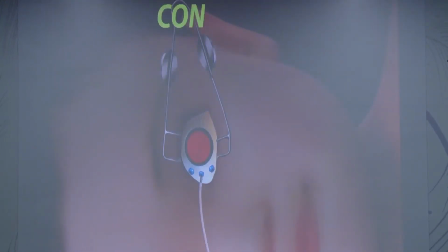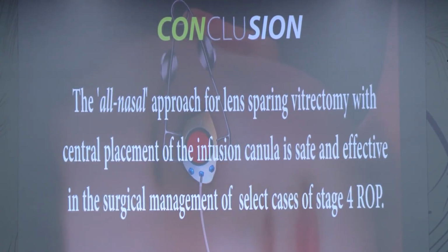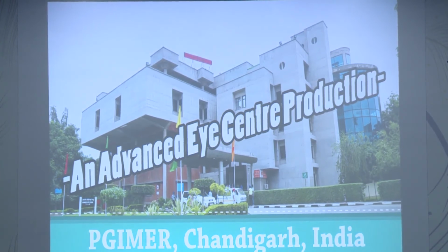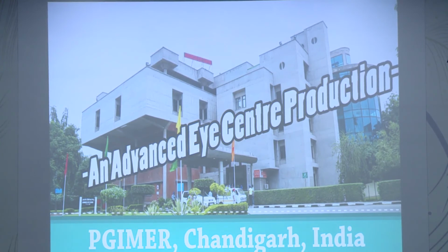In conclusion, this novel all-nasal approach for lens-sparing vitrectomy with central placement of the infusion cannula appears safe and effective in the surgical management of select cases of stage 4B retinopathy of prematurity. With proper case selection, iatrogenic retinal injury and lensectomy can be avoided in many of these eyes.